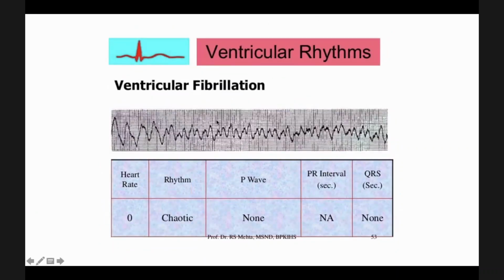Ventricular fibrillation is something bizarre, a broad complex, irregular tachycardia. What's the management? Defibrillation. Defibrillation should be done. Yeah. Why? Can you give medications? What's the place for medication here if you see a ventricular fibrillation? Adrenaline.